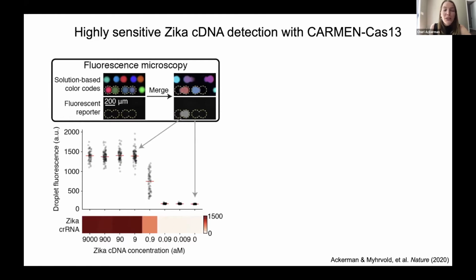However, visually representing a matrix of distributions for every experiment is super difficult. So when we display data, what we actually do is take the median and plot that as a heat map, which you can see down here. So every time that you see a heat map in this presentation, remember that what you're actually looking at is the median value of the distribution of replicates for each sample detection mix pair on the chip.